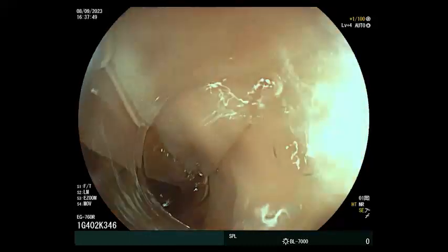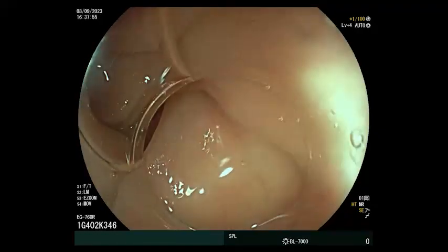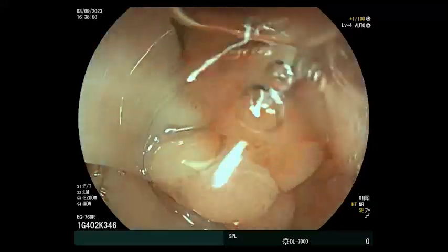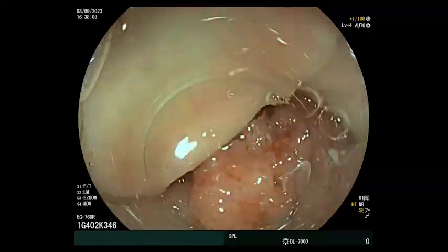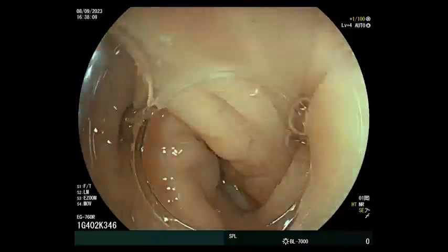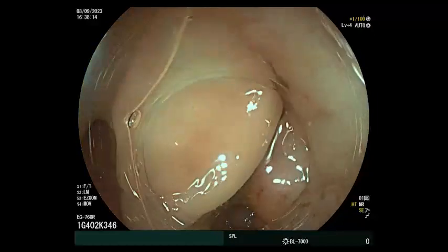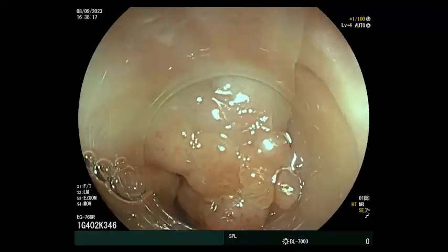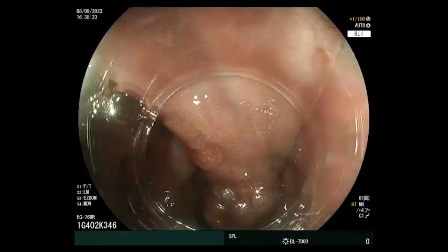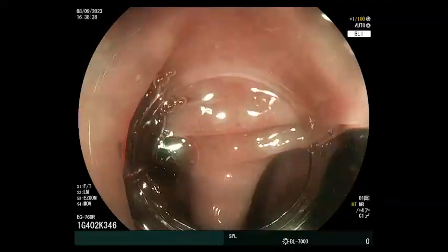Yes, because all of us expect that this long and thick pedicle has a thick or central feeding blood vessel, maybe more than one vessel. It can be a wide caliber or large caliber blood vessel. Because we are using the knife in most of our work, specifically in ESD, we prefer to cut the pedicle under vision with the knife by injecting the pedicle and cutting the blood vessels. Okay, so we will move back to room 3 and we will lead you again.